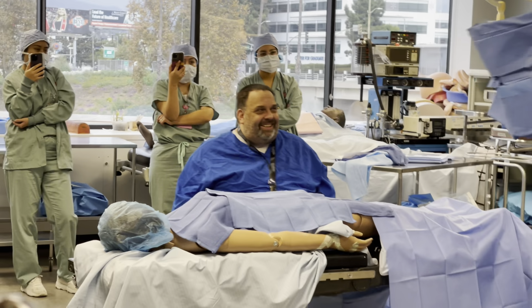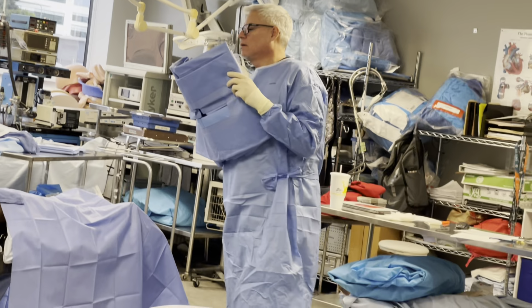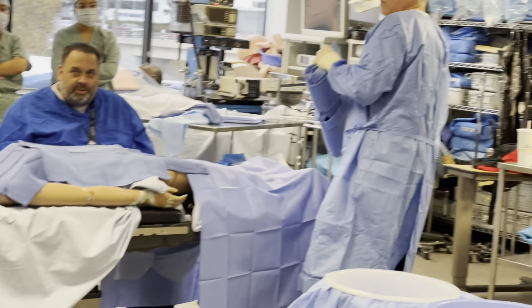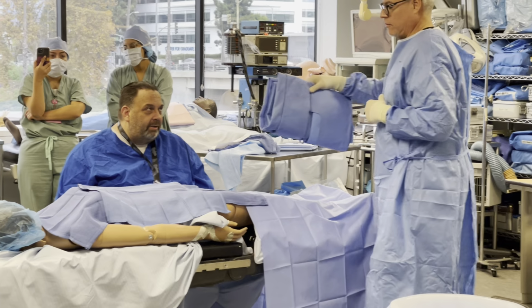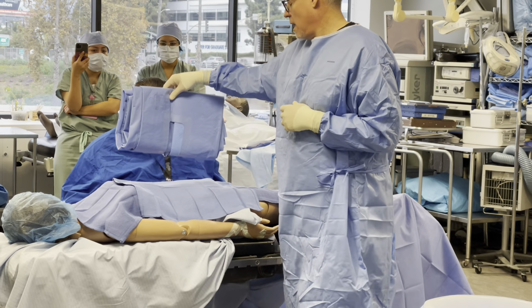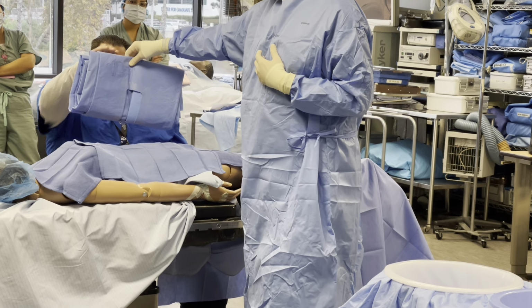How big is this hole, y'all? It's pretty small, right? Okay. We do it to isolate the surgical field. Okay, thank you. No CST question. Like so. I'm gonna walk over. Now, if my surgeon trusts me, he'll be like, go ahead, put it down. I'll drop it. Otherwise, I'm gonna hold it up for the surgeon.